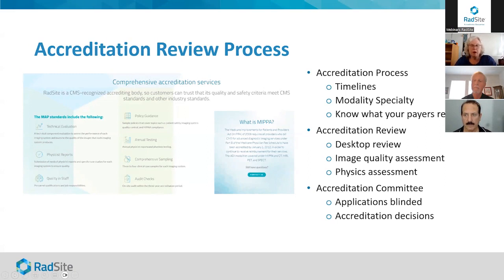Oh, the other piece is that when you go to upload your studies in AMBRA, always use the link that is provided on the studies tab, either for your images or your physics. That link is a specific share link with AMBRA that allows your images to go into your personal bucket as well as be shared with us. If you log directly into AMBRA, it will not be shared with us.